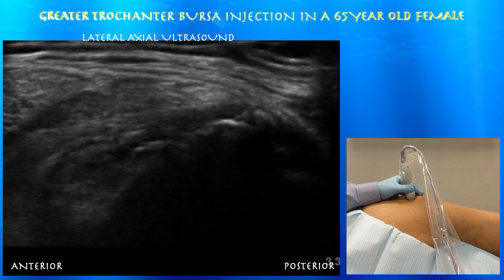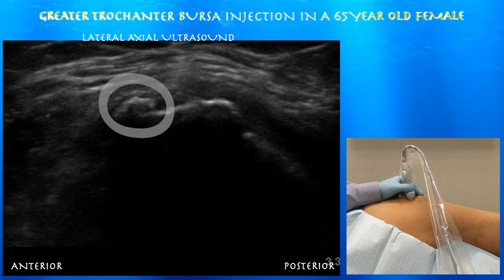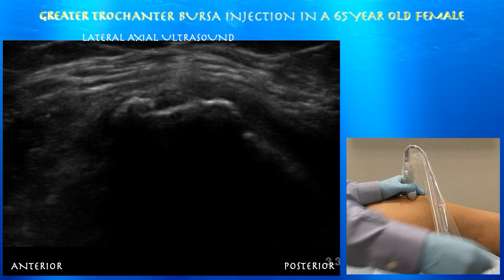We're rotating anteriorly. You can appreciate the anterior facet with the overlying gluteus minimus tendon. Here again is that irregular apex, and the gluteus medius tendon just to the right of that irregular apex versus possible intratendinous calcification.